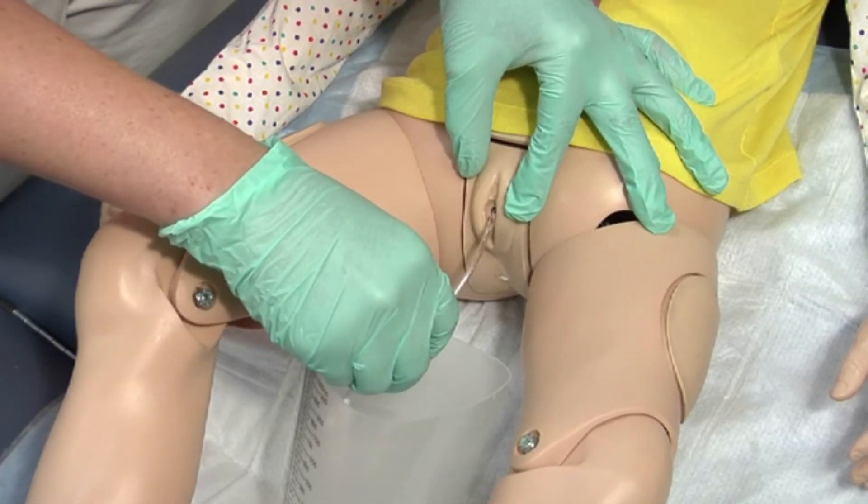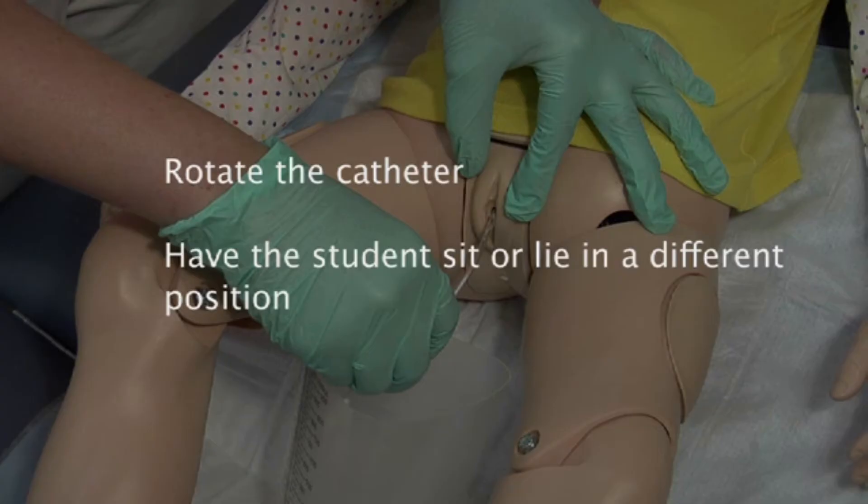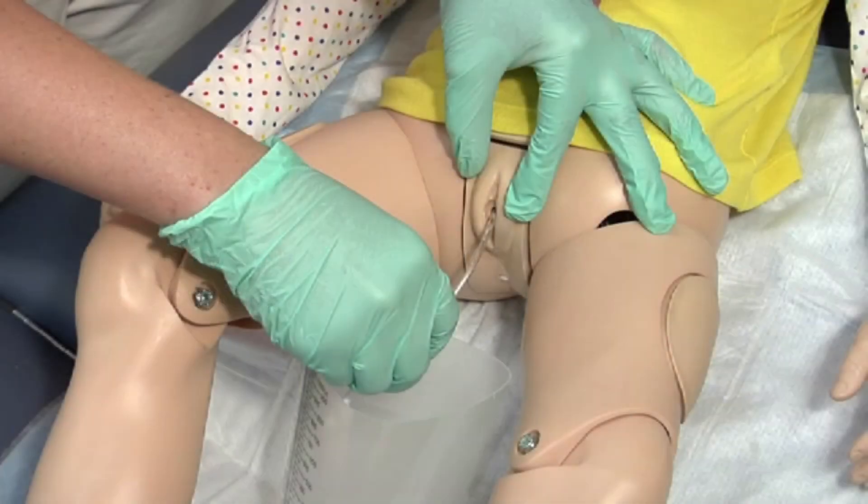While inserting the catheter, if you meet resistance, try the following: rotate the catheter, or have the student sit or lie in a different position. If you are still unable to insert the catheter or the student experiences pain, remove the catheter and follow up with the parent or guardian and healthcare provider.